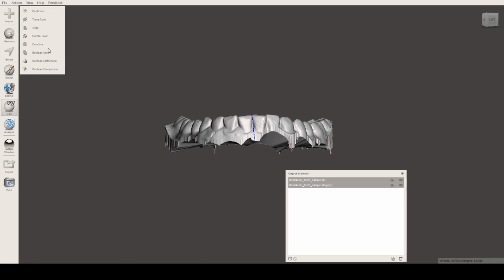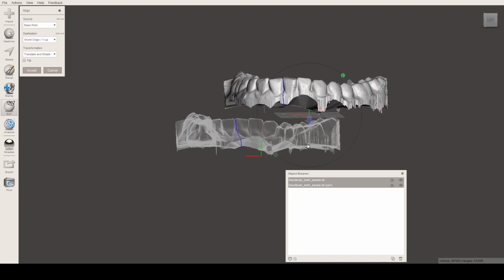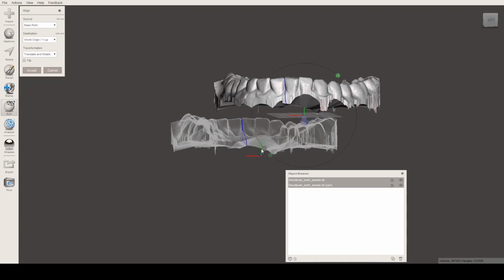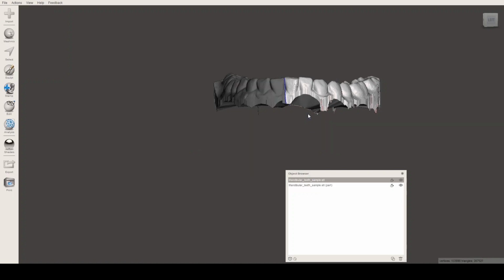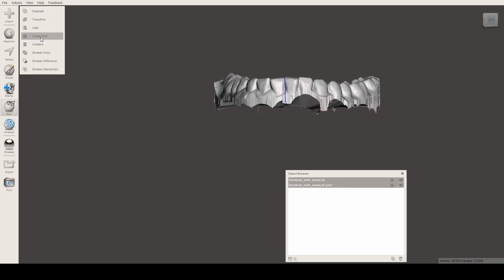Oh, there you go. You can join it together. You can duplicate it. You can transform it again. We transformed it earlier. You can align it if it's not aligned. Actually, let's try to align it. Or let's try to deform it. Oh, no, it doesn't align. You can align it only one by one. But for now, let's combine it again.